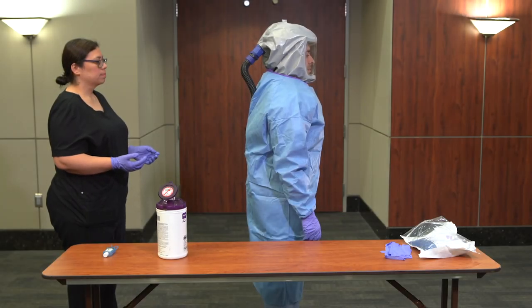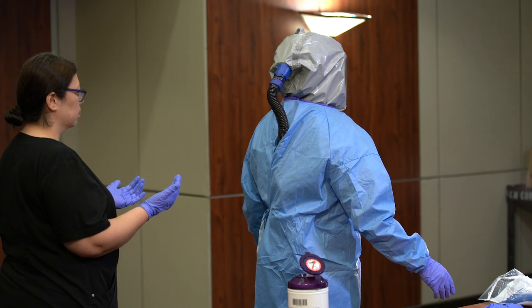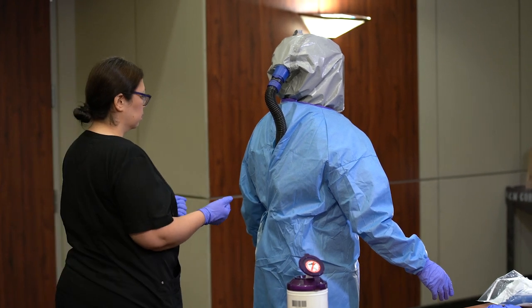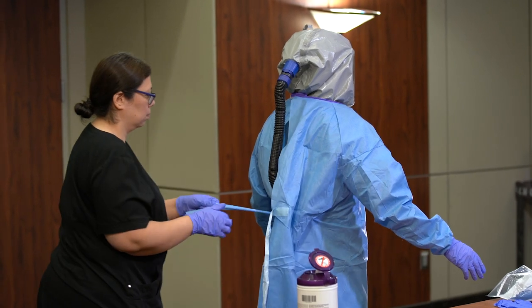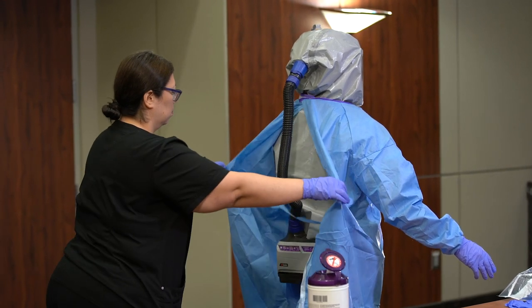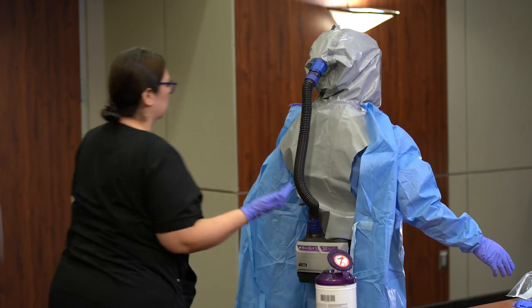In the event that you need to care for multiple suspect or confirmed COVID patients, the following procedure should be observed. Doff the gown and gloves. The buddy should perform hand hygiene and don clean gloves. Turn your back to the buddy and ask him or her to unfasten the gown. The buddy should only touch the exterior of the gown during doffing.